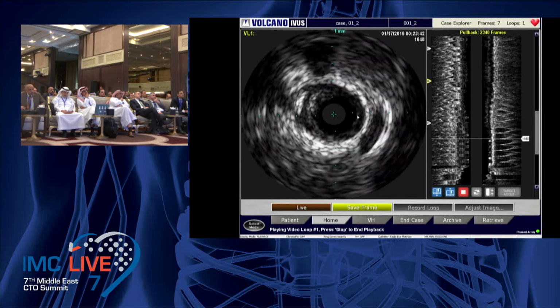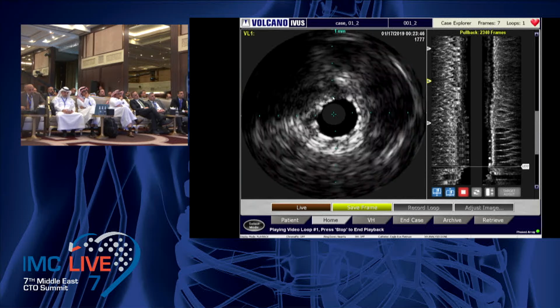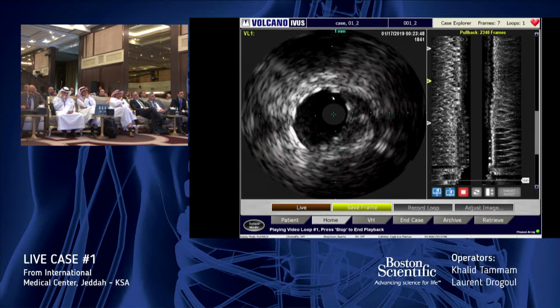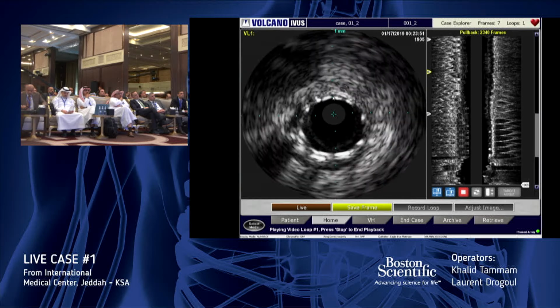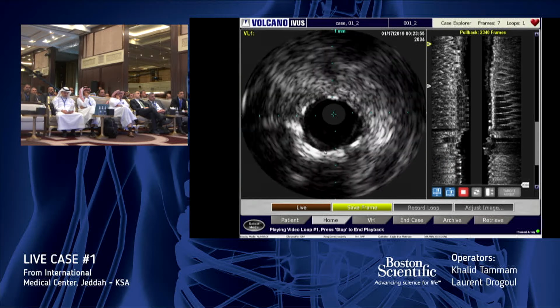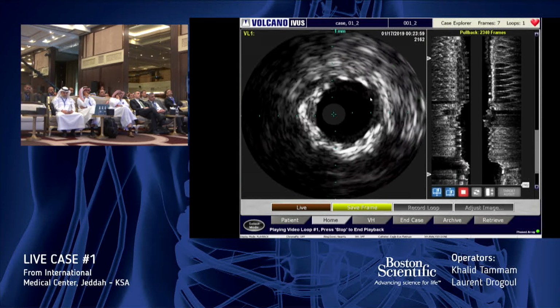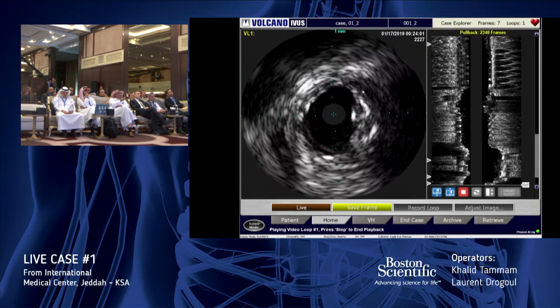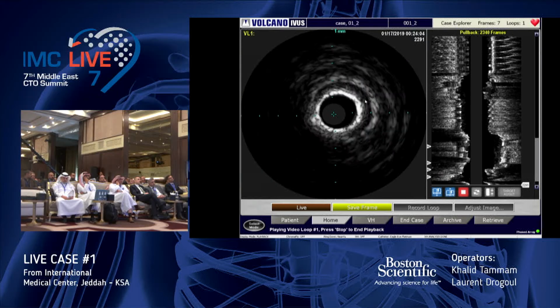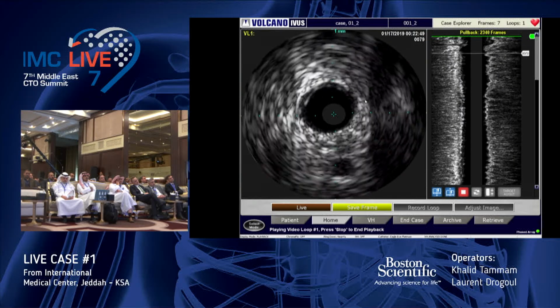You see the distal edge of the stent finishing in this large amount of plaque, which is calling for subacute thrombosis. More proximally in the stent, we see that the stent is well expanded. More proximally, we will see some eccentric expansion where the most important calcified segment was, but overall this is a very good result.